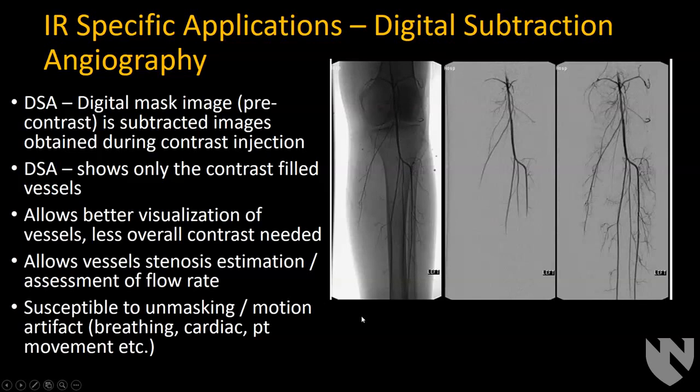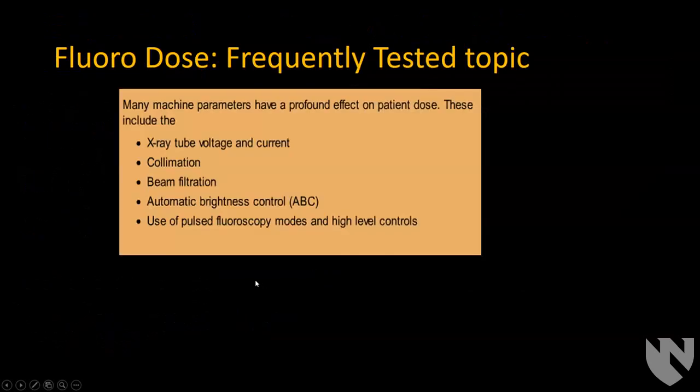Of course, there are issues with motion, either from cardiac motion or breathing or just the patient moving, and then you get misregistration and the subtraction doesn't work as well.